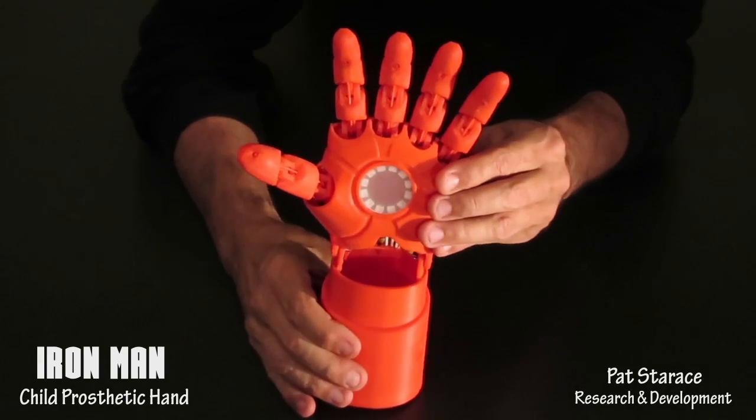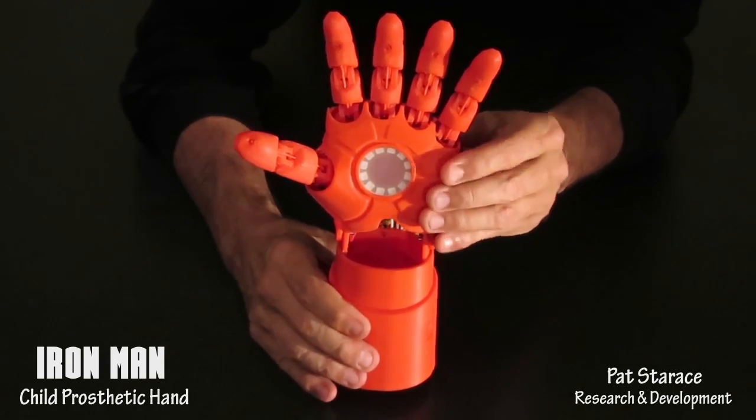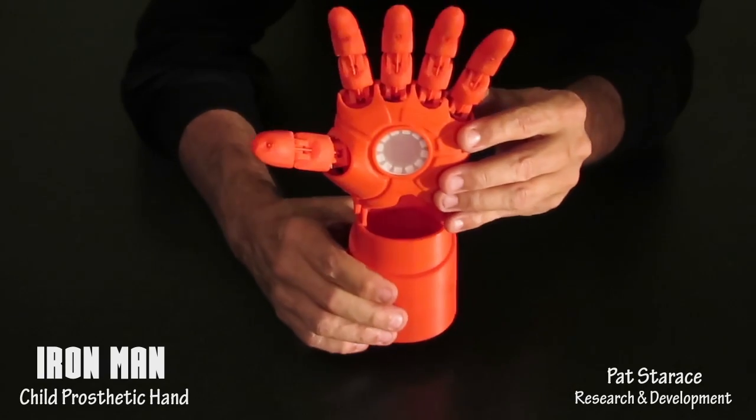The fingers have a slight spread, giving it a more powerful and visually appealing look. The angle also helps in grasping objects, and there's another reason you'll see later.